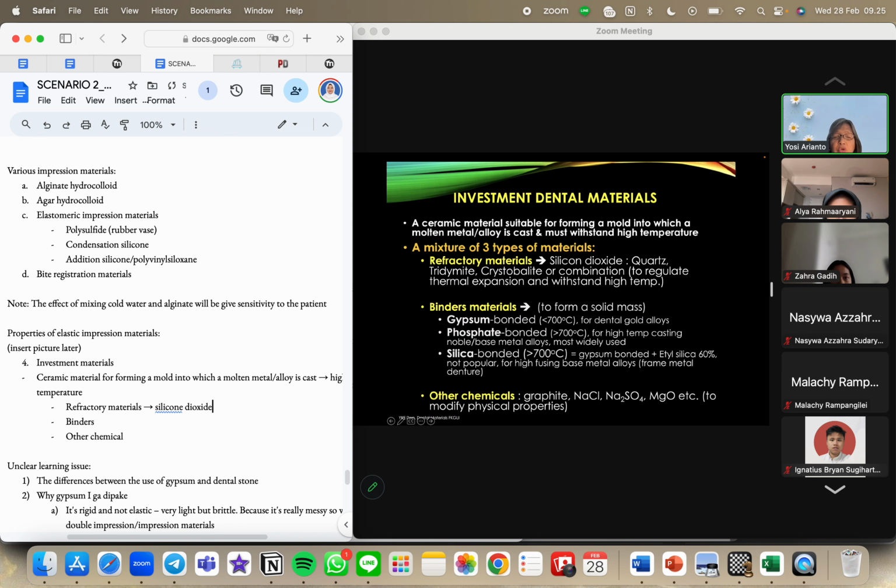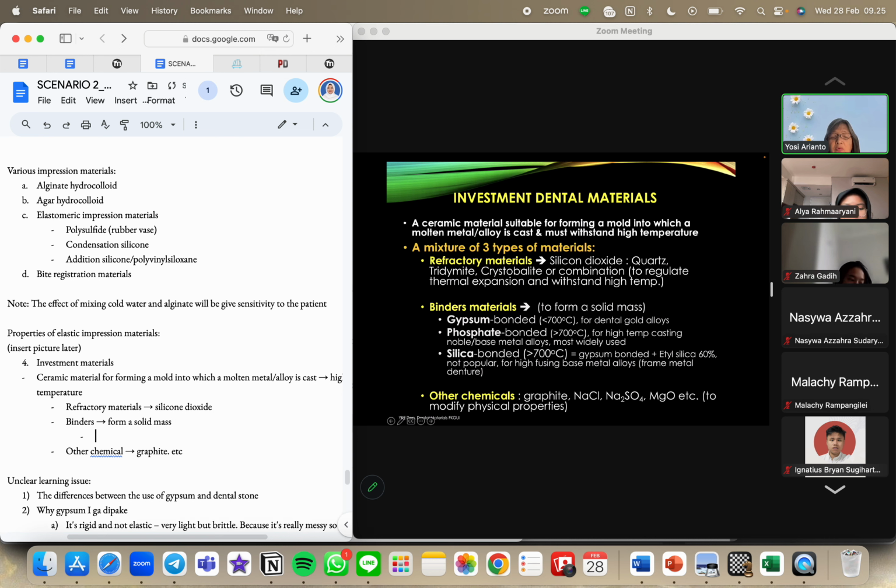Yeah, but you use the phosphate bonded or silica bonded if the metals need melting at more than 700 C. Yeah, maybe 1000, 1500 degrees C. Then you will have to use the silica bonded or phosphate bonded. Okay.